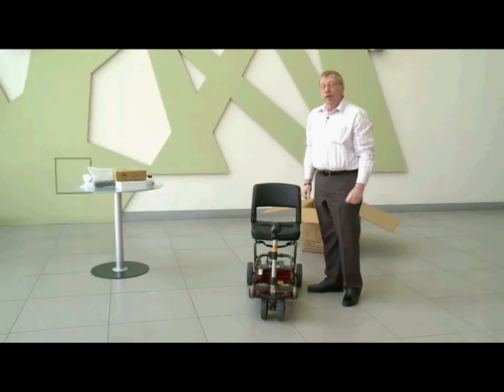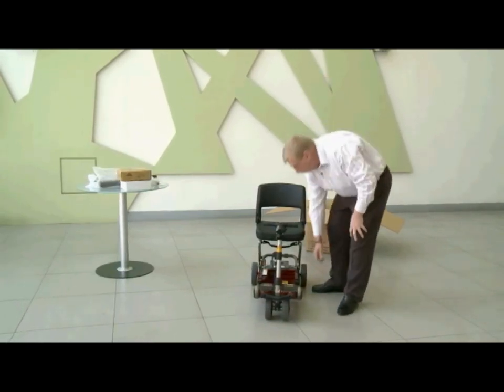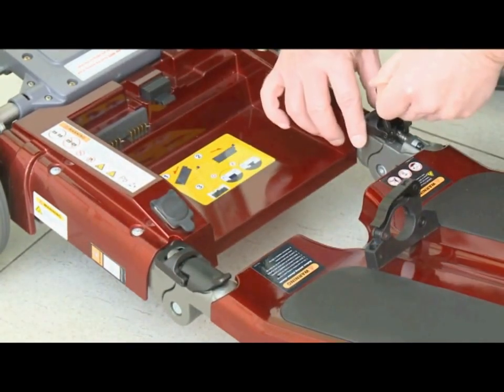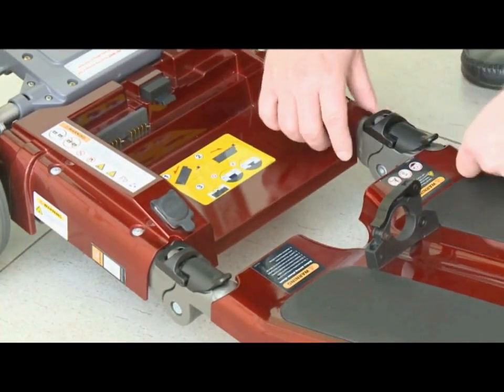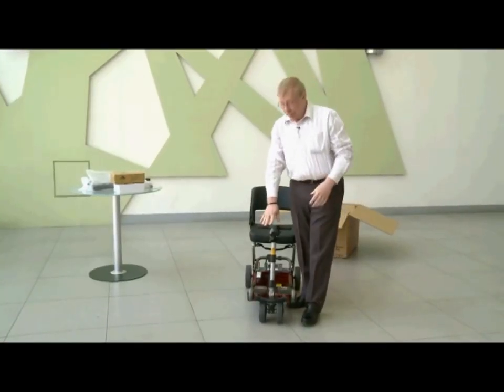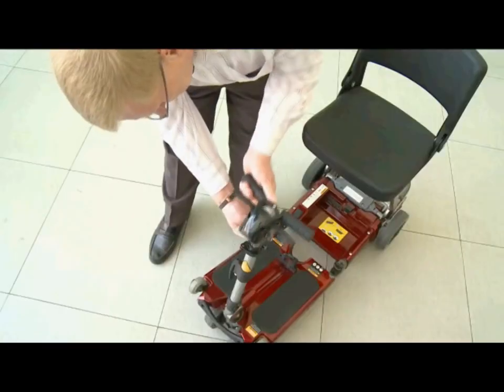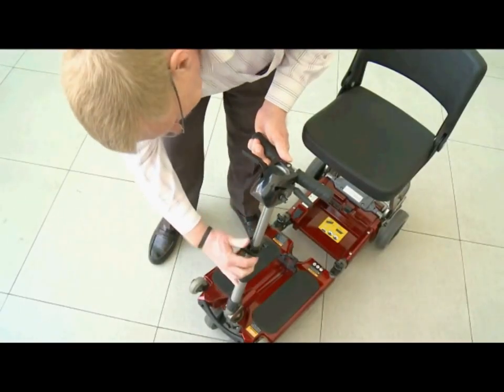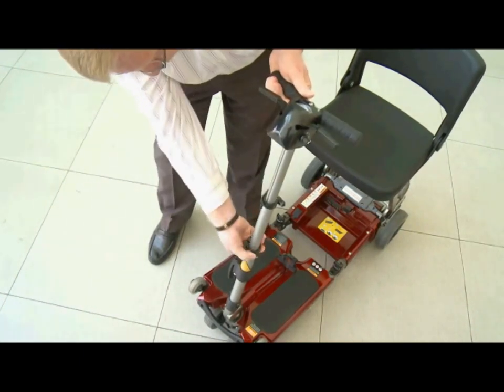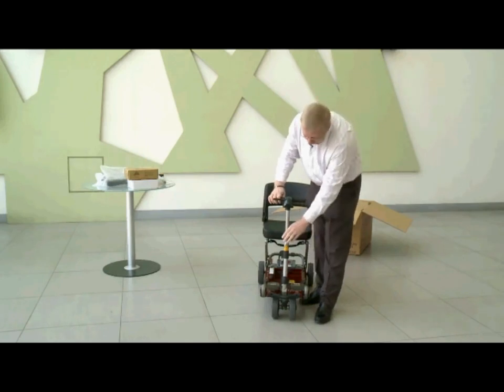The next thing we want to do is to lock the frame in place — this is very important. There are two frame locks and they just lock quite easily like so. Now you want to make sure that the handlebars are at the correct height. These are quite adjustable. There are two clamps located here; simply open the clamps, extend the handlebars to whatever height is comfortable for you, and then relock the clamps.